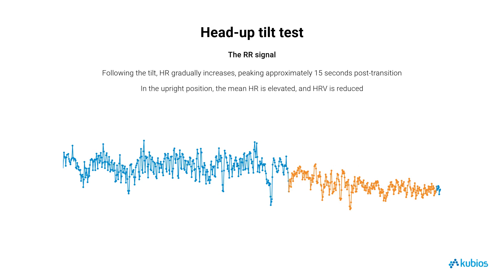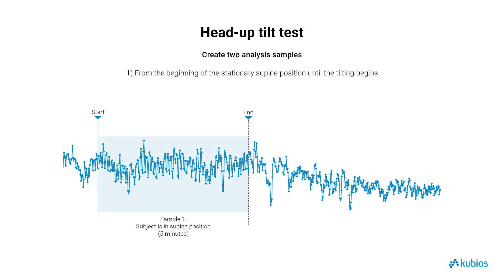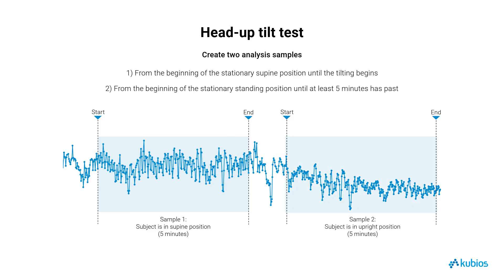In the upright position, the mean heart rate is elevated and HRV is reduced, particularly in indices sensitive to parasympathetic activity, compared to the supine position. You need to create two analysis samples in QBOs for this test: one for the supine position and one for the upright position, leaving the transition between the positions unmarked.